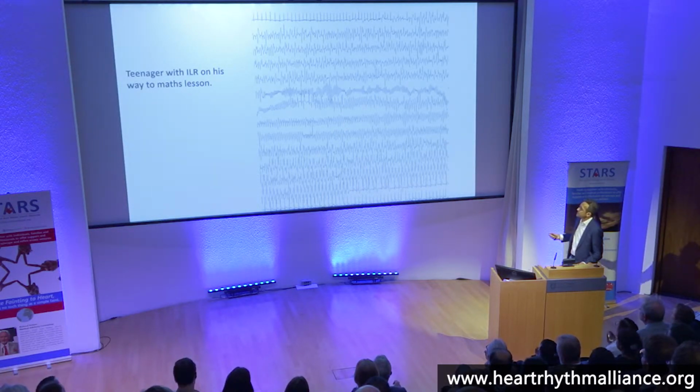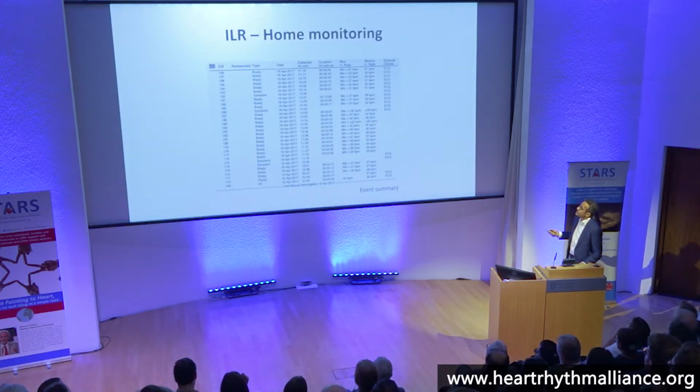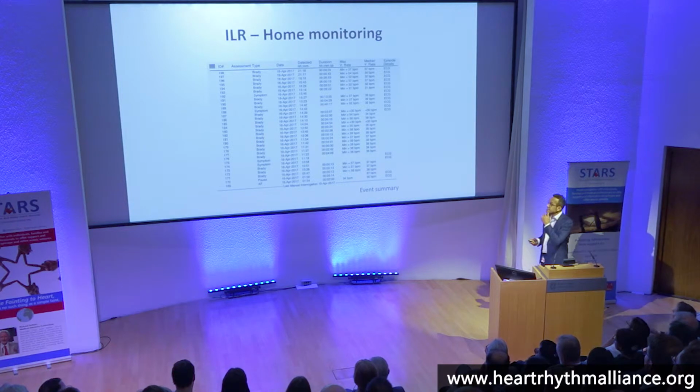Okay, this is a really lethal condition. This is CPVT. I just wanted to show you this because loop recorder implantation can be valuable and you can pick up things that you wouldn't expect. Okay, this is what a loop recorder download looks like.